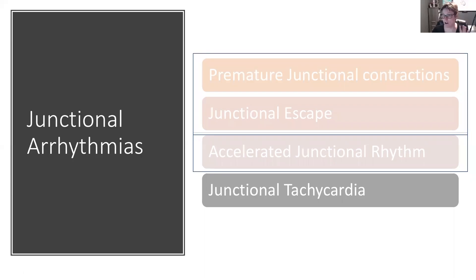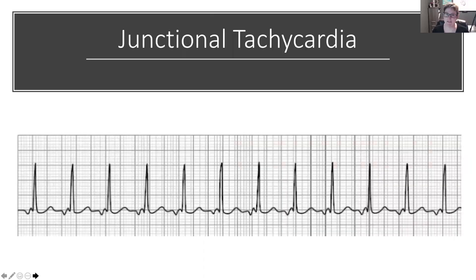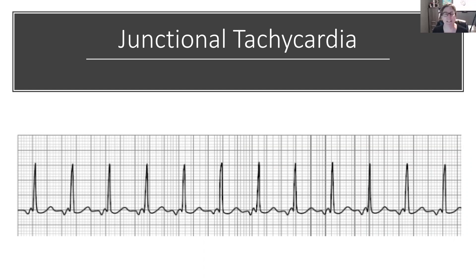Junctional tachycardia — the fourth of four rhythms. Here we have an example of junctional tachycardia. It looks pretty regular at first glance; it looks like it could be a sinus tachycardia, but what we're seeing is this inverted P wave. If I haven't said 'inverted P wave' enough times for you to associate it with junctional rhythms, I haven't done my job. That is a classic hallmark.